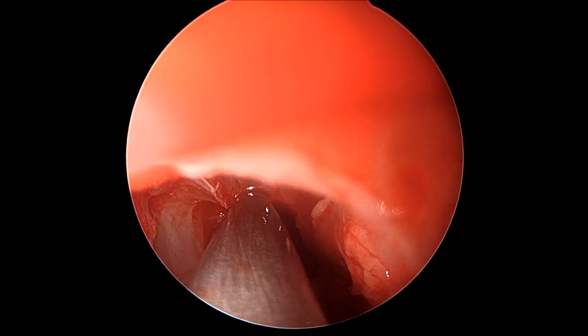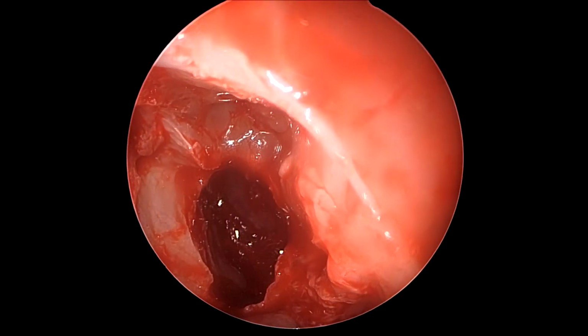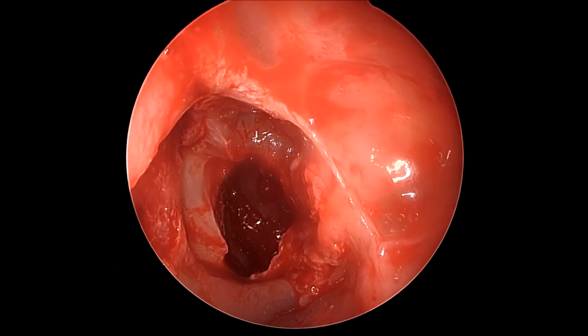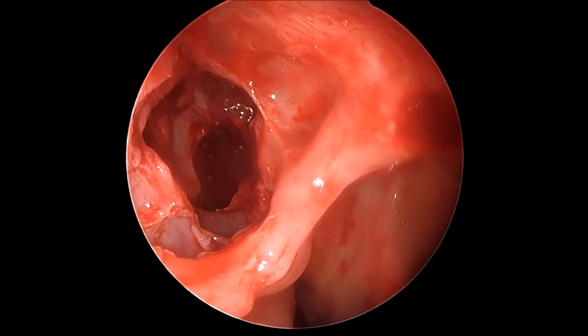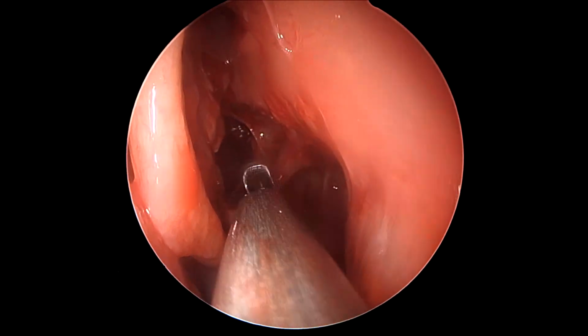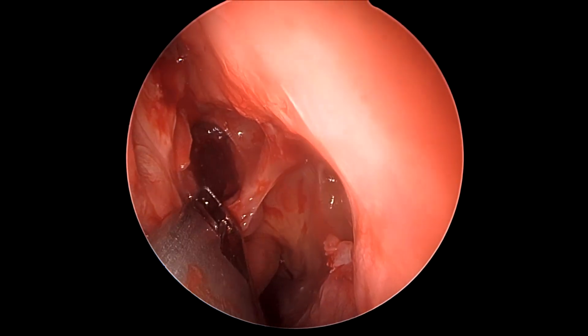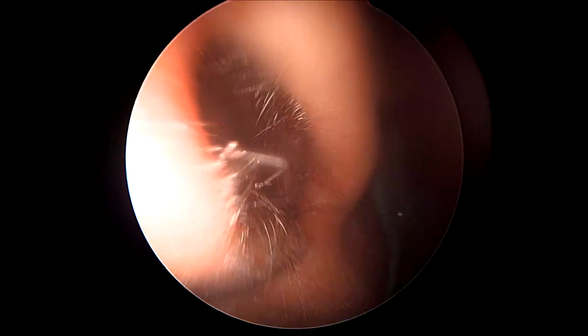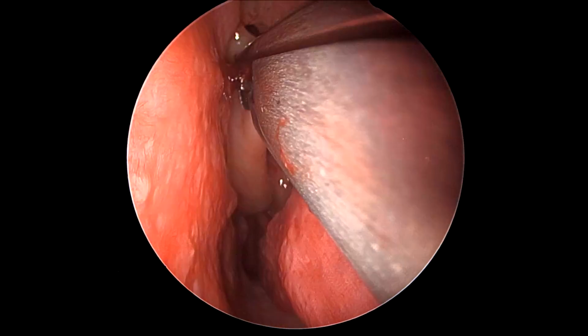I once again say that one must attempt completely to remove all the possible causes of failure, the usual failures in sinus surgery, though one cannot ensure that there would be no recurrence, because the polyp disease itself has a propensity to recur. But at least the surgical causes of recurrence, the known causes, can be addressed and have to be addressed in all revision surgeries to be sure that from a surgical standpoint, there are no stones left unturned.